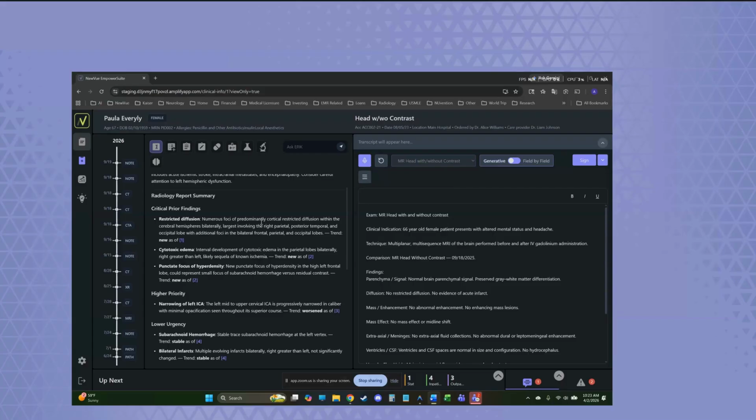So if context matters for accuracy, how are you currently getting the clinical context that matters for that accuracy? And too often, the real answer to that is you're not getting the context. Oftentimes there is an order form for the study. Sometimes that'll have some information. Sometimes it really doesn't have much of anything. It might just say pain or something like that. And it's up to you to go find the information that you think is necessary. And usually some amount of that information is available.